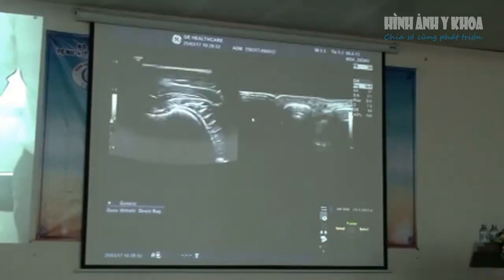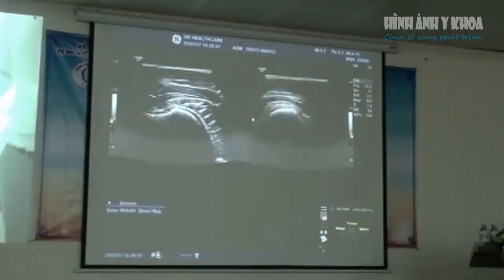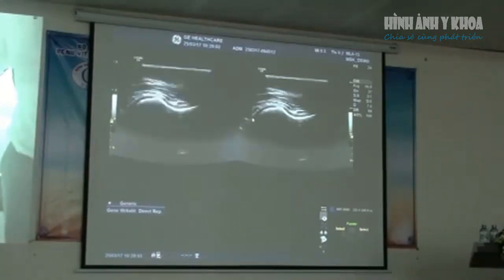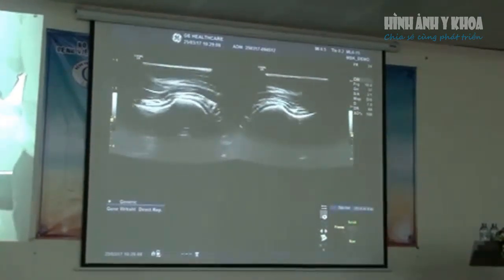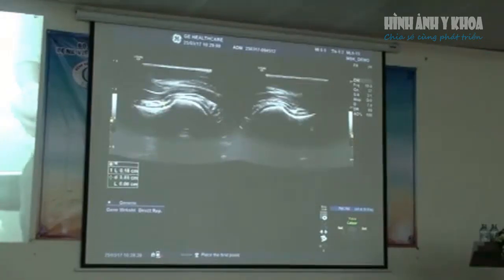So what you do is just have a look at both sides. So the best way to look at it, you just get a little bit of the proximal shaft, and then this is where the inferior aspect of the humeral head, and then this is coming into the inferior recess here. So this little structure just here is the inferior glenohumeral ligament.